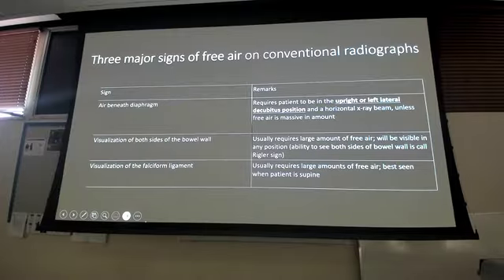If I lay on my right side, say it again: stomach and the gastric bubble, right? When I lay on my side, I'm trying to get that air to rise to the peritoneum area so I can see it. I got all liver here. It's going to hide, just like it should. If I flip on the other side, that stomach's going to shift, that air from the gastric bubble is going to shift, and that free air in the abdomen could be hiding behind that gastric bubble.